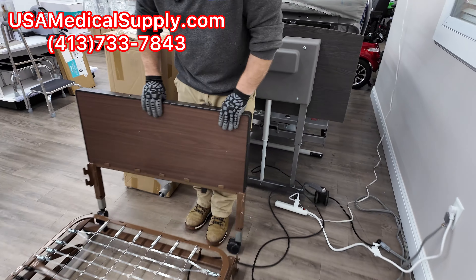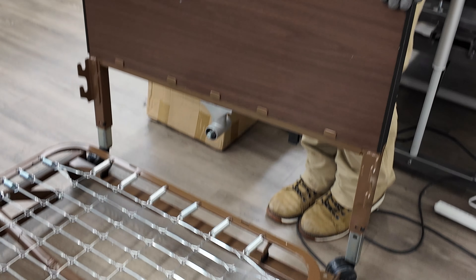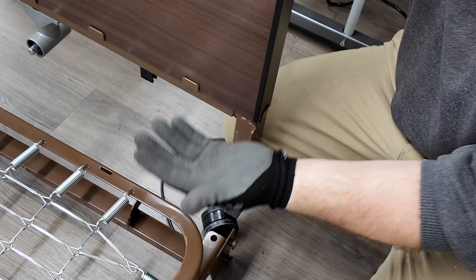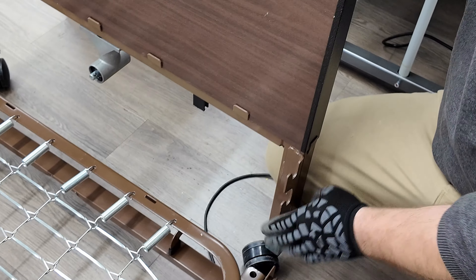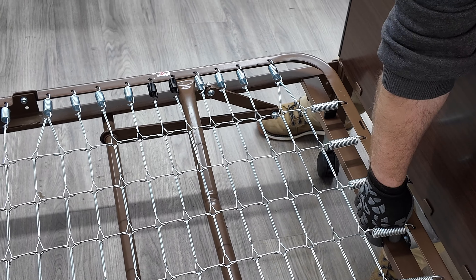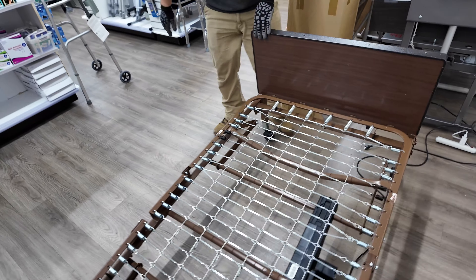Installing the headboard can be a little challenging if you've never done it. If two people are available it will be a lot easier, because you have to get both pins into the slots on both sides simultaneously — you can't do one side first. The only way to do it is to keep the board level and load both sides at the same time. If you're by yourself, grab it from the middle so it doesn't tilt to one side.